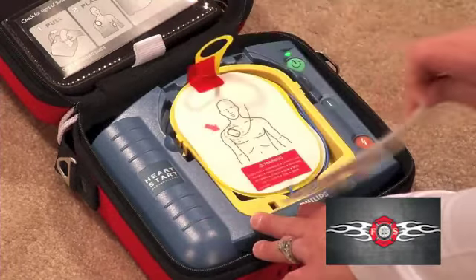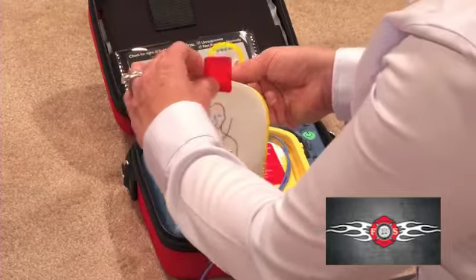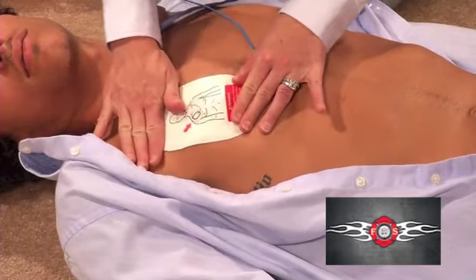These are the electrode pads. Look carefully at the pictures on the white adhesive pads. Place the pad exactly as shown in the picture. Press firmly to the patient's bare skin.